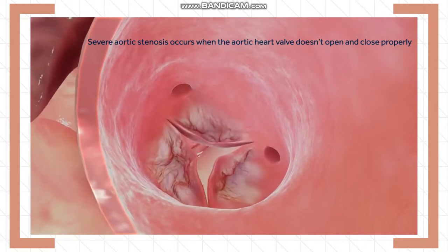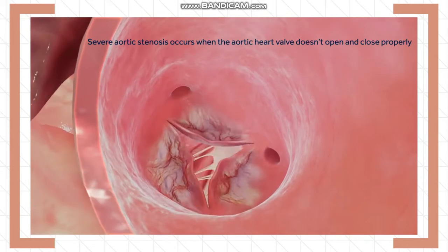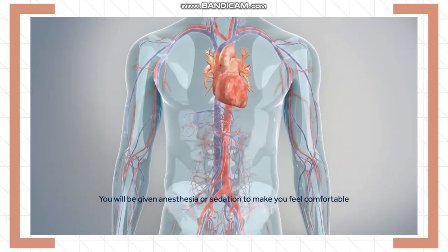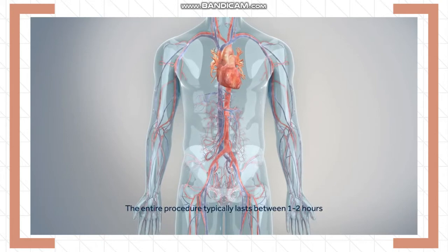to excessive calcium buildup. This makes your heart work harder to pump blood through your body and limits your normal daily activities. Before the procedure begins, you will be given anesthesia or sedation to make you comfortable. The entire procedure typically lasts between 1 to 2 hours.